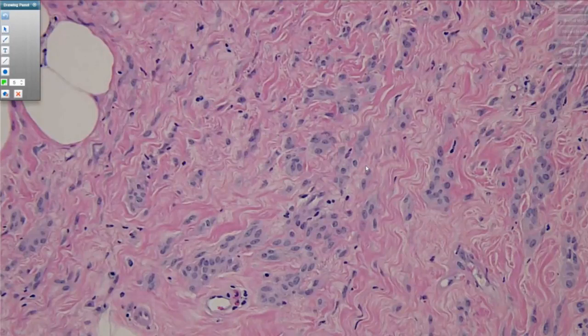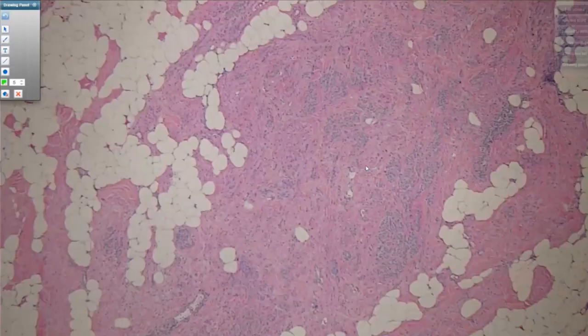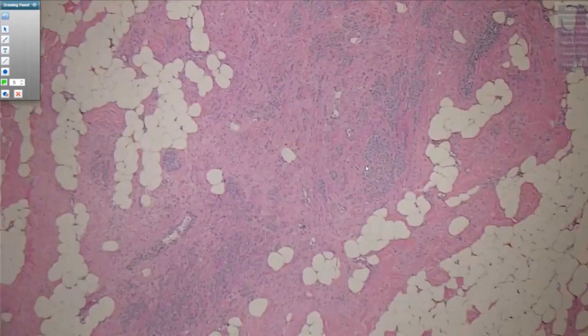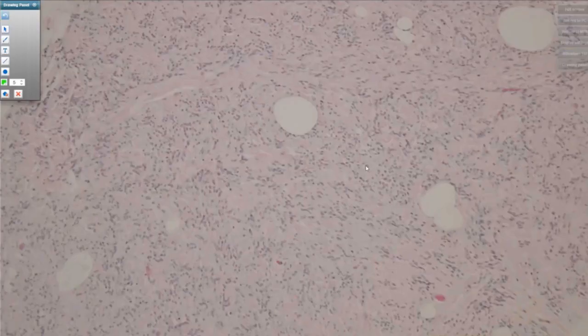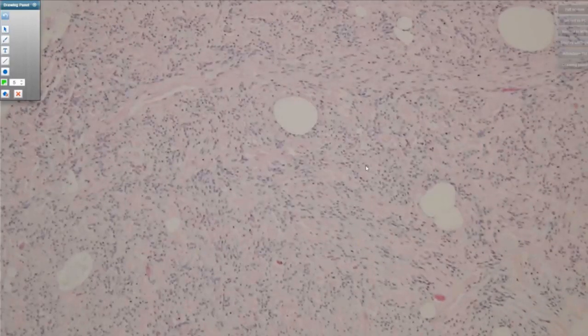That's a potential diagnostic pitfall in only performing one antibody on a lesion such as this, and not including a broad differential when you're trying to decide where to go with the lesion. So take home points for this particular case with spindle cells: CD34 positive, ER positive, cytokeratin negative. This supports classification of this lesion as a myofibroblastoma.